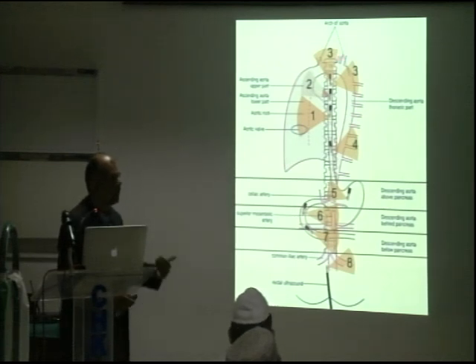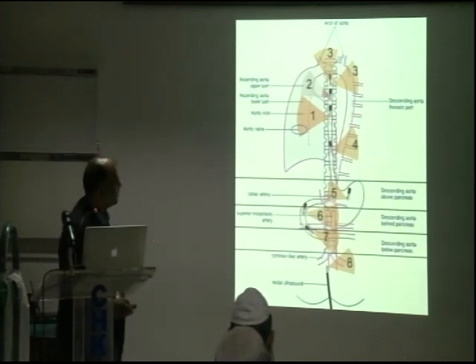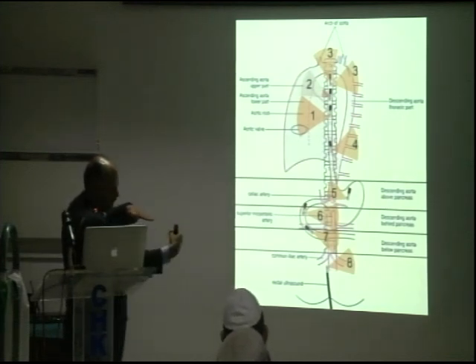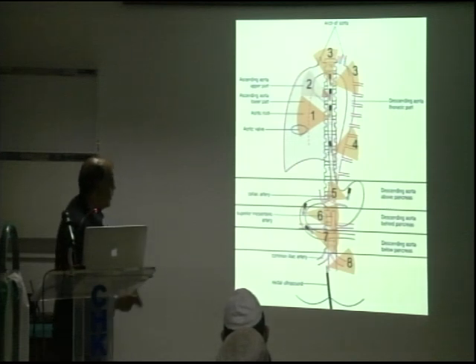Transducer is facing anterior. Yeah, that's true. Of course, if you're looking at the heart, then it's facing anteriorly, right? But the patient is like this, so it is actually like this. It is facing anteriorly and it is like this. All right, so then the rotation would make sense and the structures would come.